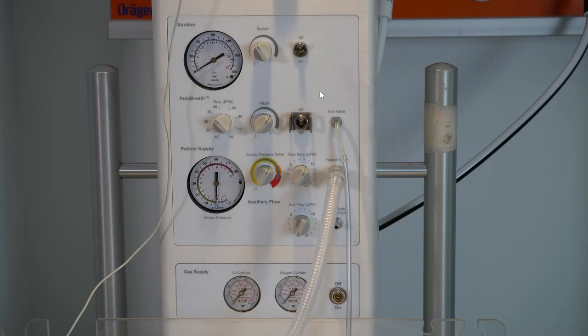You can place it on the right side of the abdomen. You must just be careful, remember that any baby's liver tips at about a centimeter. So it's best to go closer to the umbilical area than right on the right side of it. I'm not fond of it because I don't think it's as accurate as if it's closer to the umbilicus or more to the left. But, you know, that is what it is. Thank you, Linda.